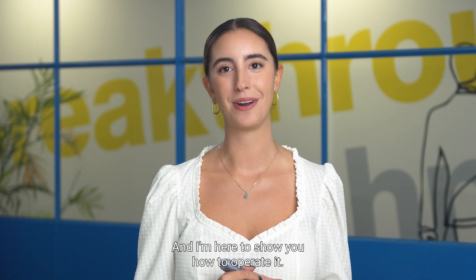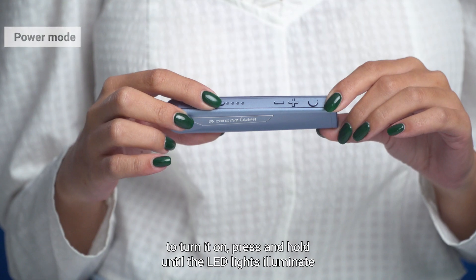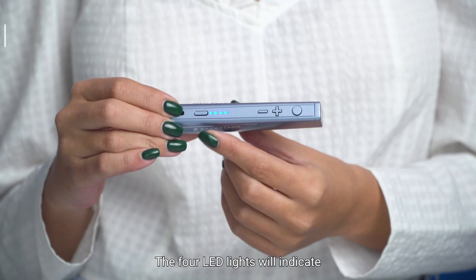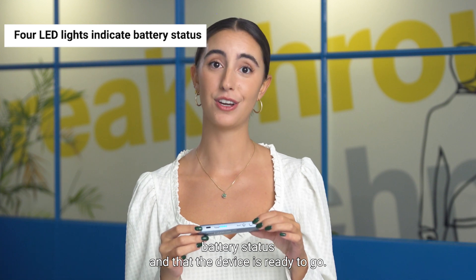I'm here to show you how to operate it, so let's get started. This button powers the device on and off. To turn it on, press and hold until the LED lights illuminate, and then wait to hear the device's announcements. The four LED lights will indicate battery status and that the device is ready to go.